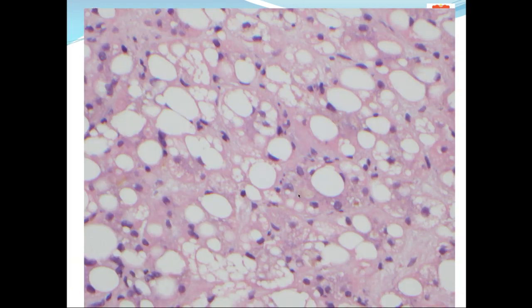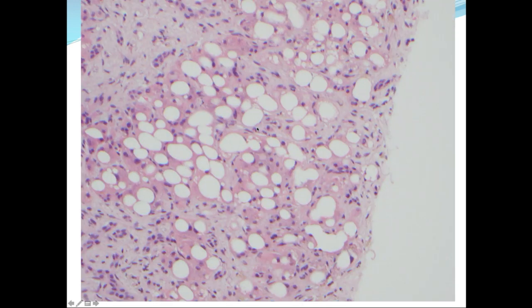Looking more closely at the liver itself, there's obvious ballooning present in multiple sections. And again, for any residents who listen to this, to distinguish ballooning from macrovesicular steatosis: in macrovesicular steatosis, we like to see a large droplet of fat pushing the nucleus to the side, whereas in ballooning, the nucleus remains relatively central, and you get this characteristic change in the cytoplasm.